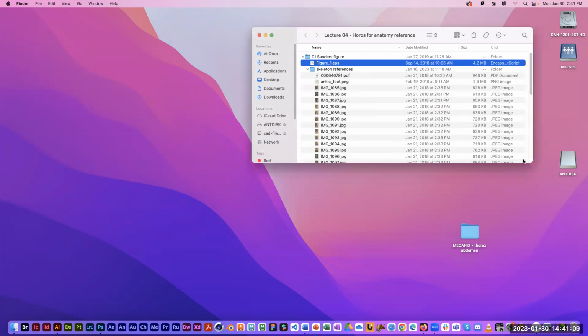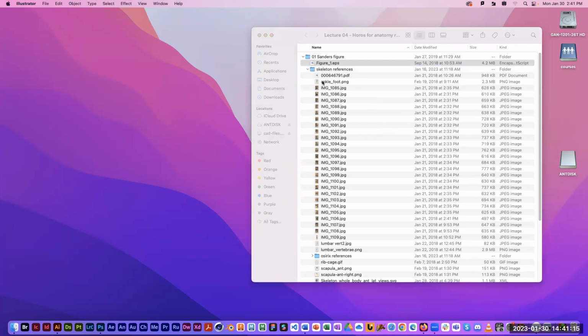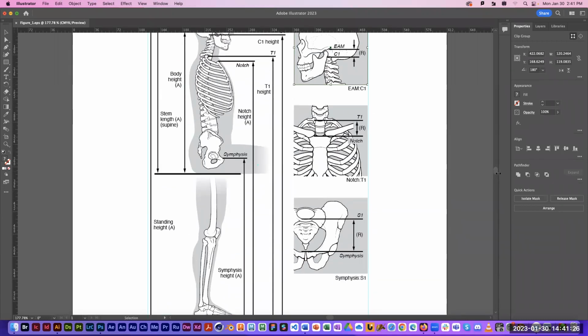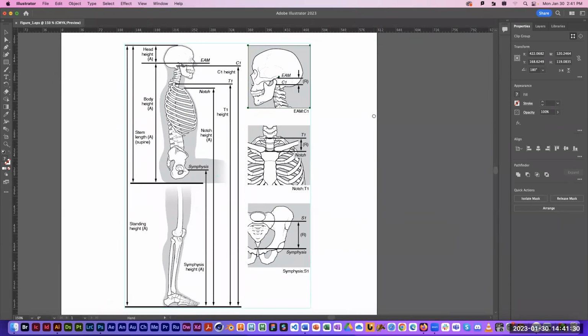All right, so I had a project. Let me actually show you the finished project first. I was working with an orthopedic surgeon at U of R, and just a little background about the project.